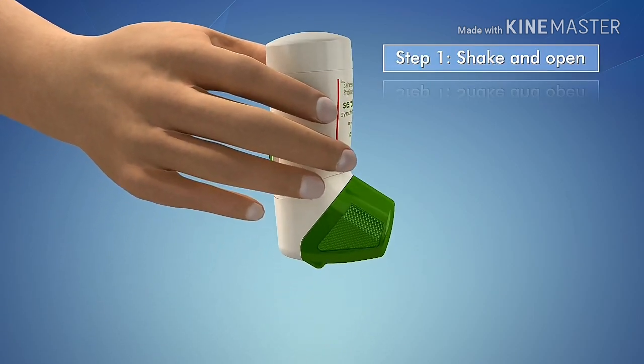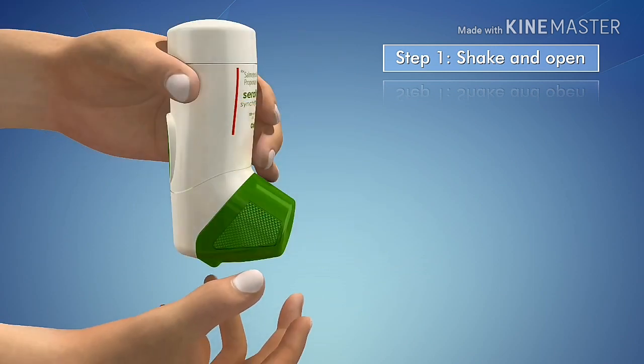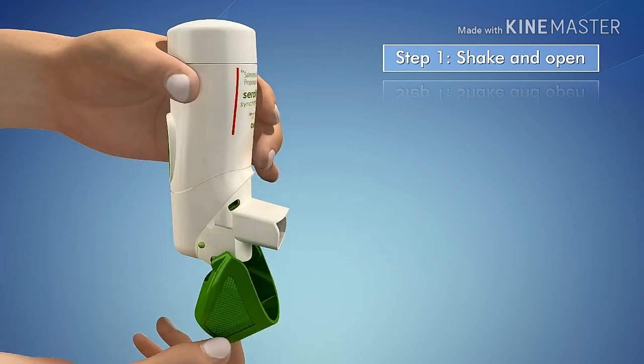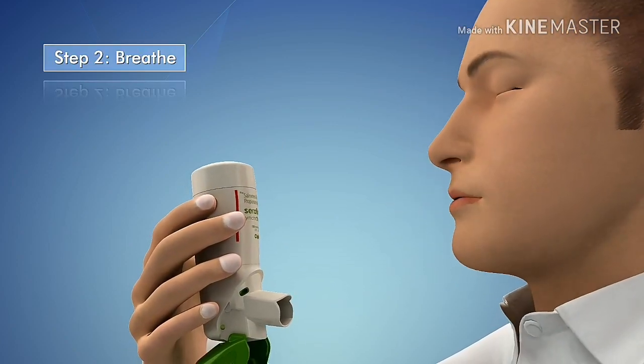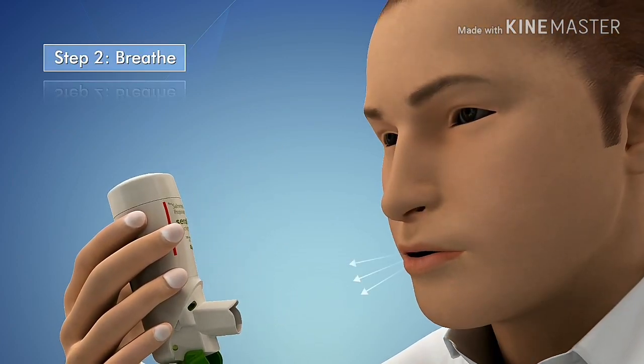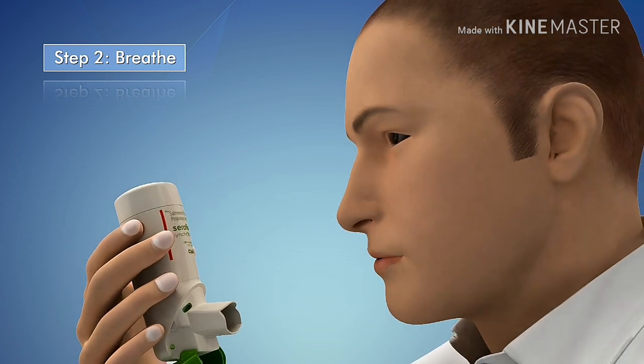Step 1. Shake the inhaler well and open the inhaler by folding down the mouthpiece cap. While sitting or standing, hold the inhaler upright. Breathe out normally as far as it is comfortable through your mouth.